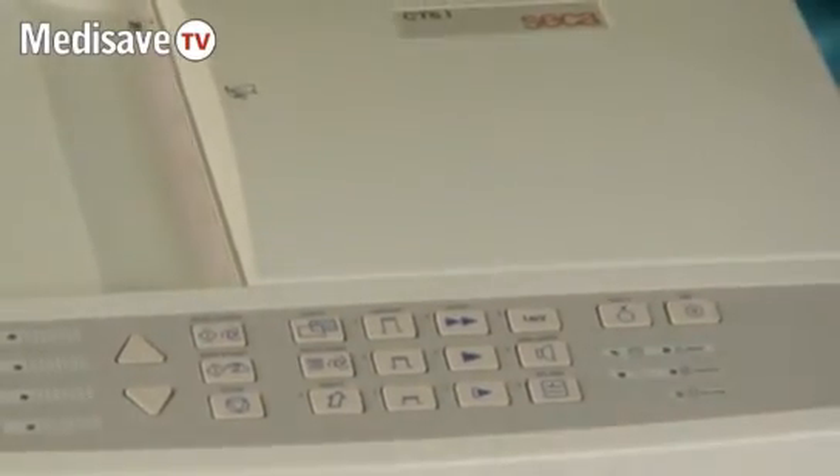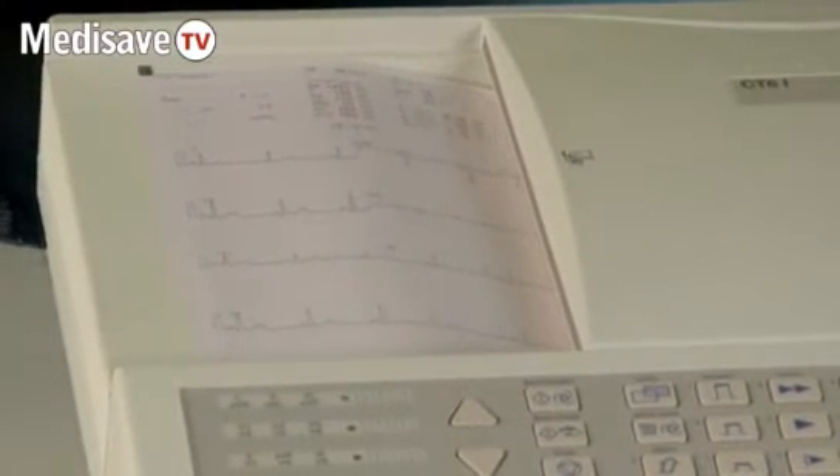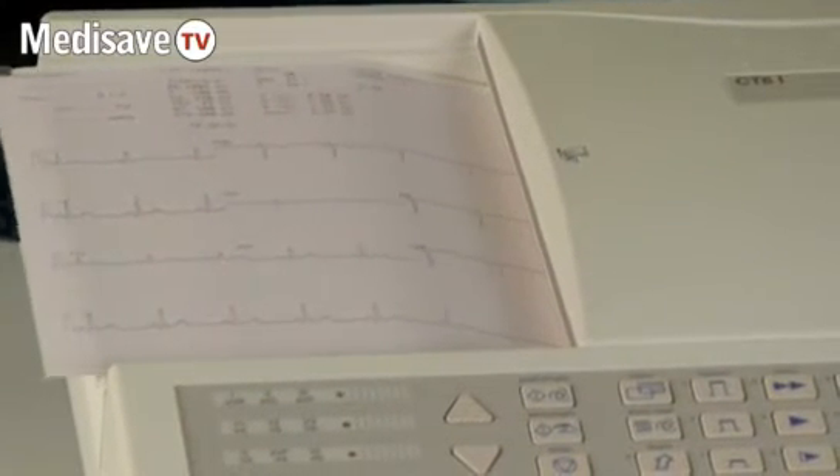The four green lights will flash on the machine and the ECG machine will print out an A4 one-page ECG.